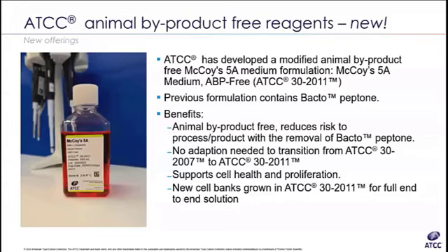Have we done any sequencing on the cells that are specially made to be grown in the reformulated new McCoy's medium? Yeah, so we're really spoiled with our bioinformatics system, and we are going to be using that resource to get an RNA-seq panel. We're going to look at some critical metabolic pathways, and we're going to have comparison data. So you'll see the data of the cell line grown in both formulations. So if you need to switch from one to the other and you have regulatory burdens, this is another piece of information to support that switch.